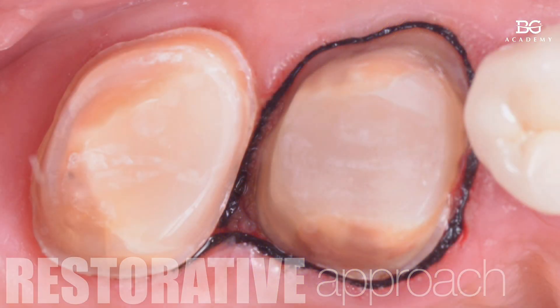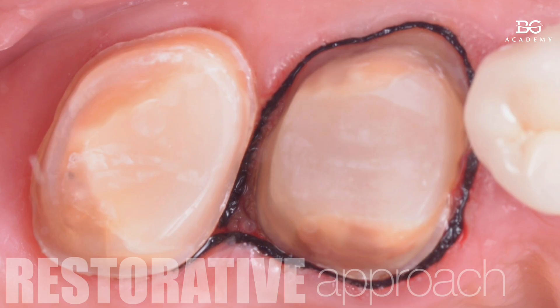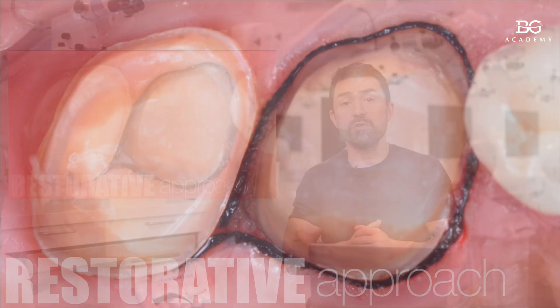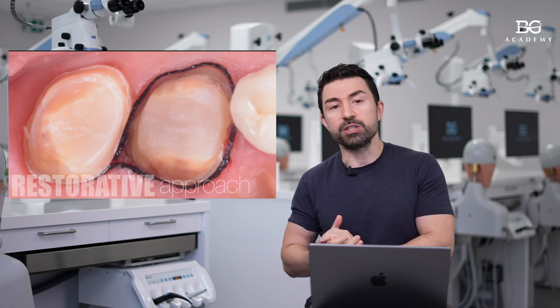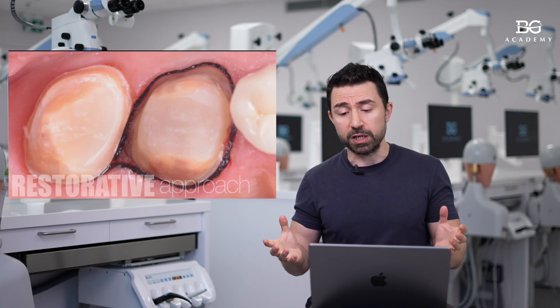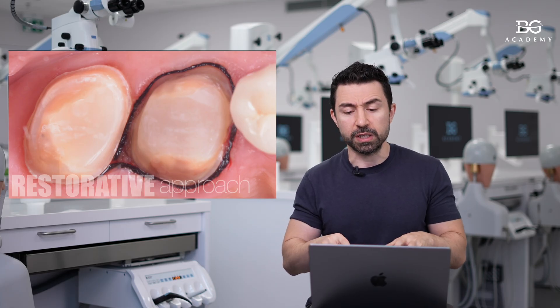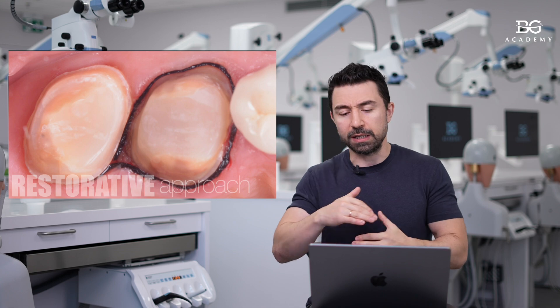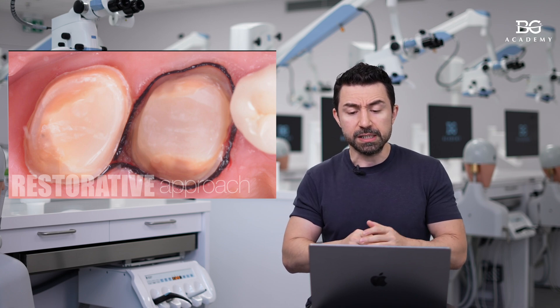Then you're done. You prep the teeth for crowns — because in this case we are going to do crowns. We prep them, make provisional restorations, and reschedule the patient for the next appointment. The pulp chamber was filled with Teflon and also with composite resin.